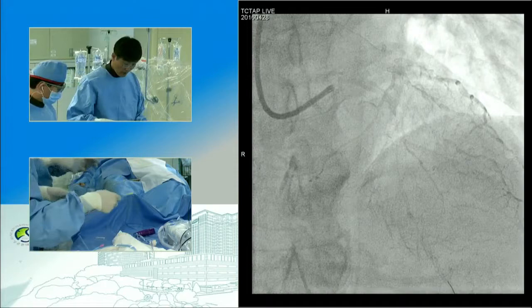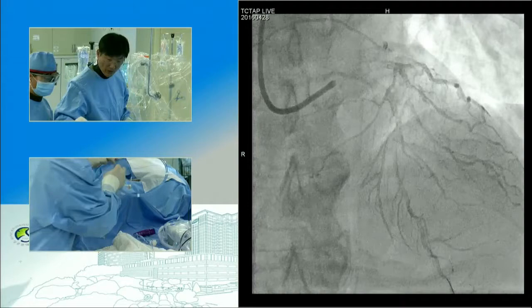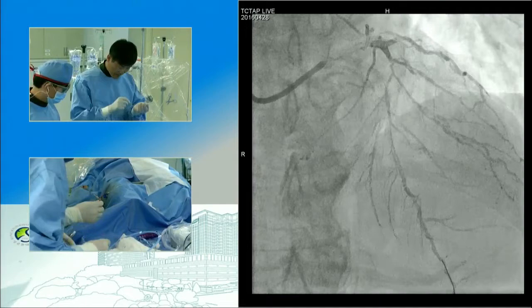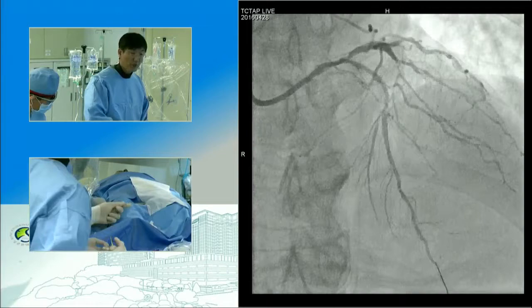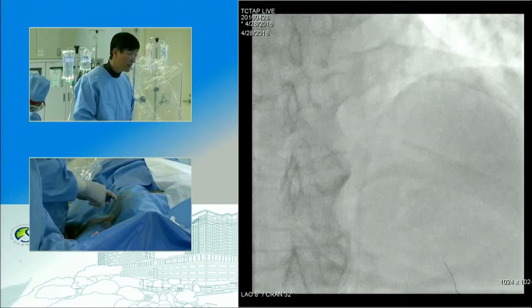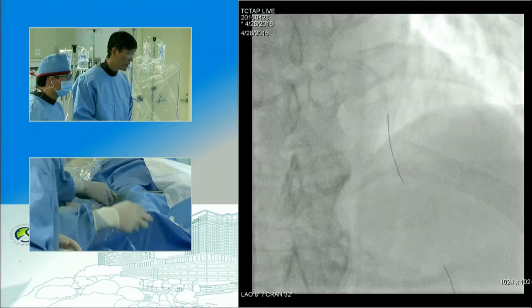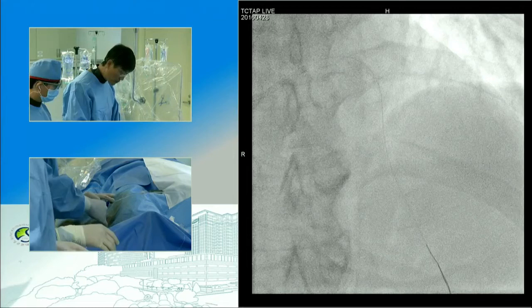Fortunately, we don't have a very severe complication. Still there, right. Yeah. One of the reasons why I aggressively ablate the lesion is that I don't like to lose the diagonal. There are many predictors of side branch occlusion, but there is no very good procedural predictor of how to protect the side branch. Jailed wire was negative in our COBIS registry. Predilatation was negative in our registry, but positive for protecting the side branch in the randomized trial done in Spain. So only predilatation is protective to the side branch technically, but you don't like to predilate it. It is diagonal, right? So I think the only thing I can do is debulking. That's the only way. I'm not sure it's working or not, but I think it is the only way.